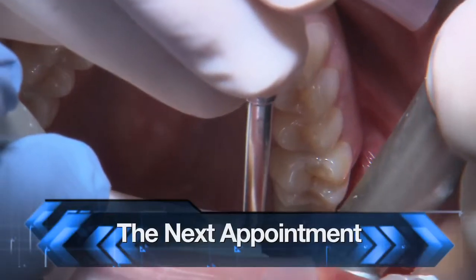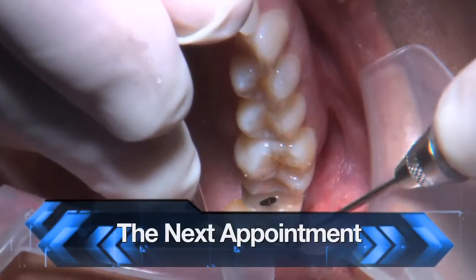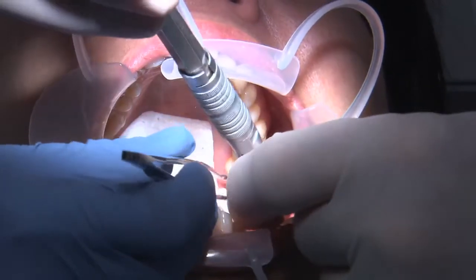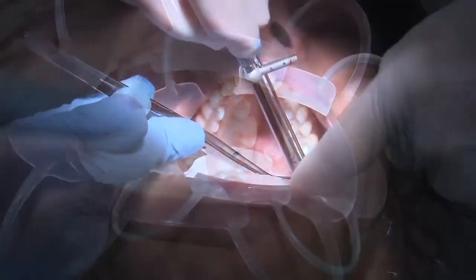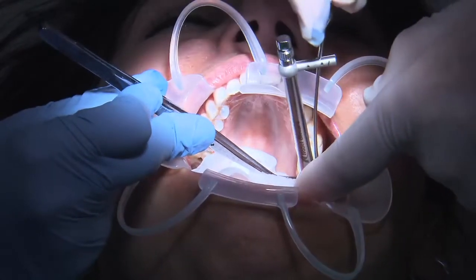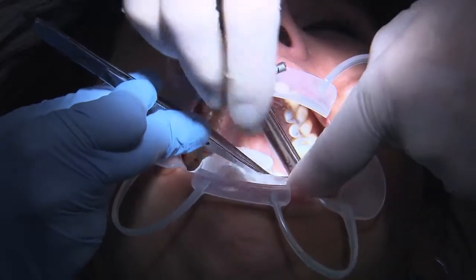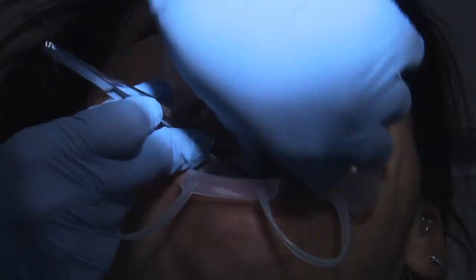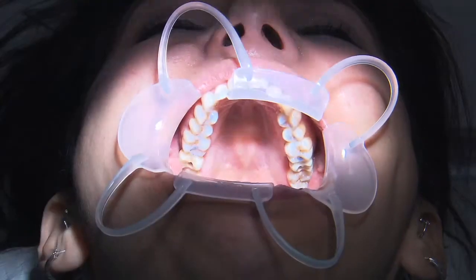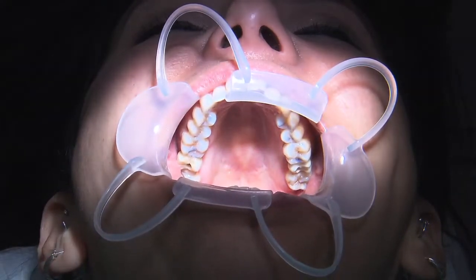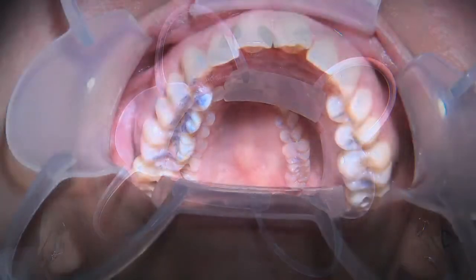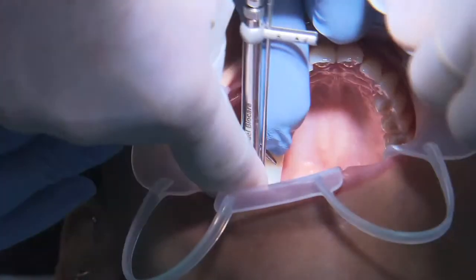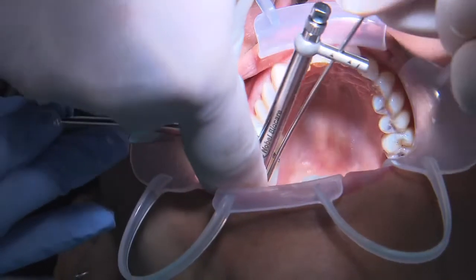Delivery is a simple procedure. The BioTemps are removed and the internal chambers of the implants are irrigated and dried. The restorations are seated and the abutment screws tightened. Because the gingival architecture was sculpted by the BioTemp restorations and the contours were transferred to the lab through the iOS scanner, the restoration drops easily into place — no blanching or fighting with the soft tissues. Once the interproximal and occlusal contacts are checked and any necessary adjustments made, the abutment screws are tightened to the recommended torque.